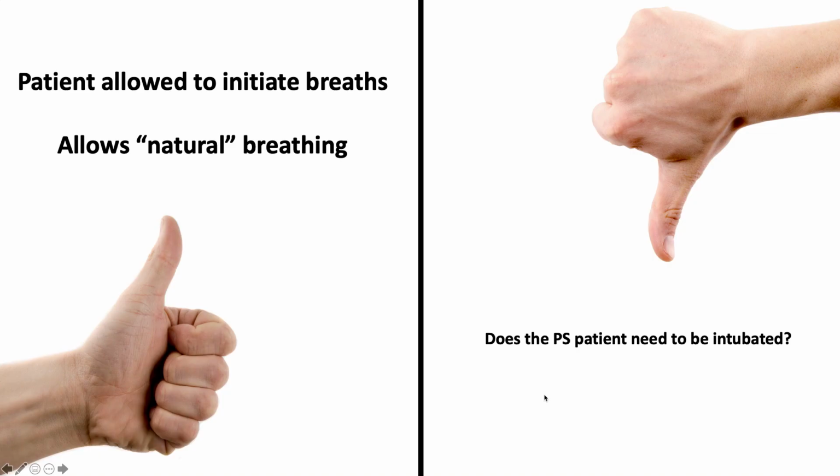The positives of this is the patient's allowed to initiate the breaths and allows for more natural breathing. So this may be a mode that we use in the hospital, especially when weaning someone. If maybe we just had to do a procedure, a GI procedure, and scope the stomach or something, and now we want the patient to actually come off the vent, we might use pressure support. But the question in the field is, does the patient really need to be intubated if they're just on pressure support? And that's something for you to decide.